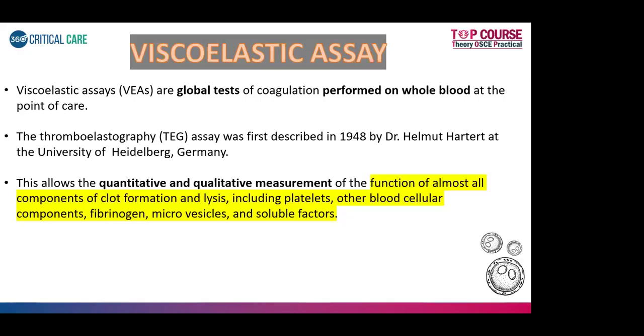That is one of the advantages of viscoelastic assay as compared to the regular coagulation parameters. Just remember it allows both quantitative and qualitative measurements of all the components involved in the formation of a clot. That is your coagulation factors, your platelets, and your fibrin. All these things are tested and studied in viscoelastic assay. And most importantly, lysis of the clot is also something that we can study with the viscoelastic assay, which is usually not understood by your routine PT, aPTT, INR. So that is another advantage of viscoelastic assay compared to your regular PT INR.